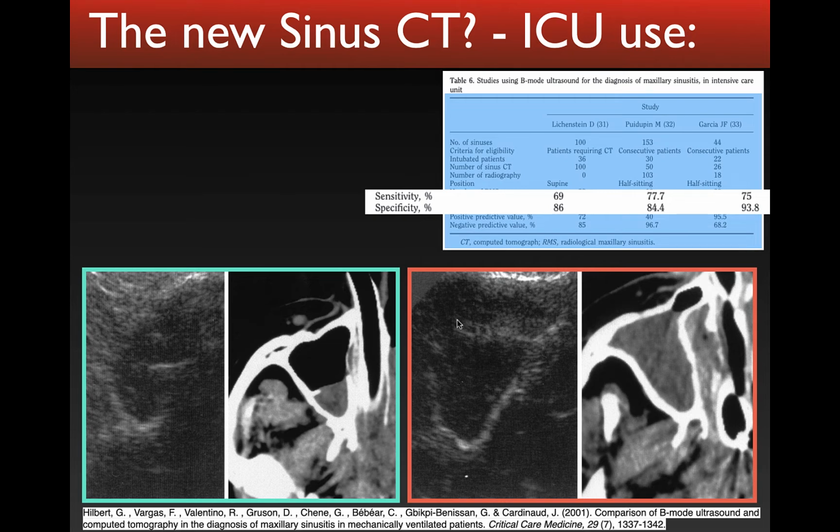The sensitivity for this isn't awesome. It's about 70 to 75%. The specificity is fairly decent, but at least it saves these patients having to go to a CT scanner and helps in patients where you've got some clinical uncertainty about their diagnosis.